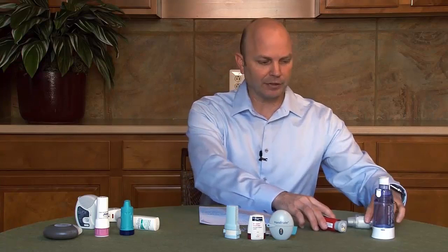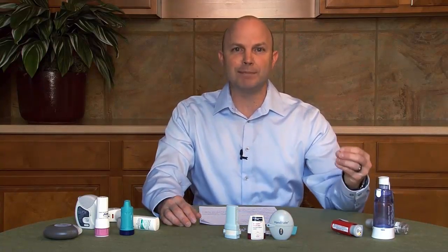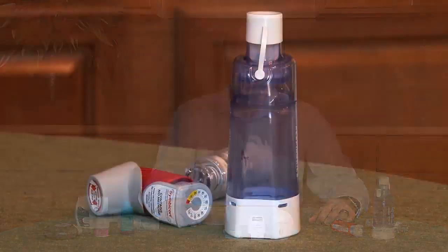Other things to know about the pressurized MDIs is that you want to take a slow, deep breath. This allows the medicine to slowly reach the lowest parts of our lungs where it needs to be deposited.